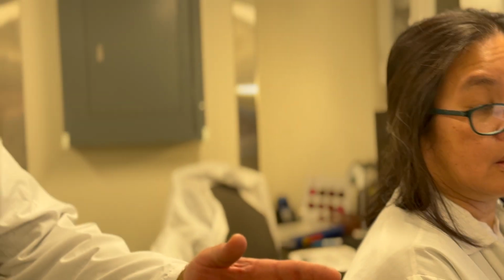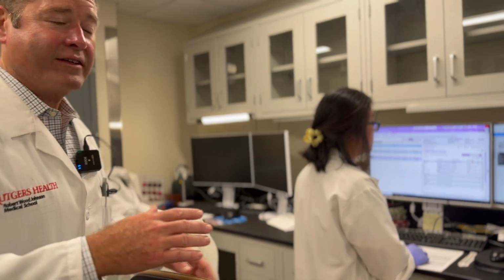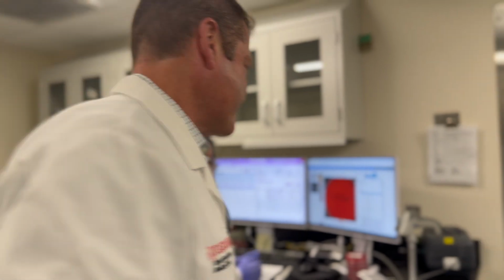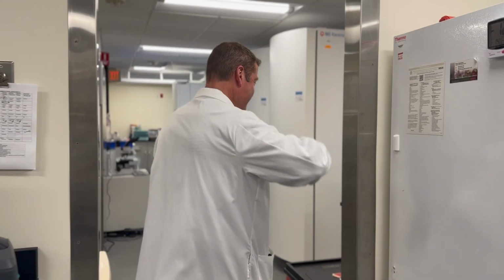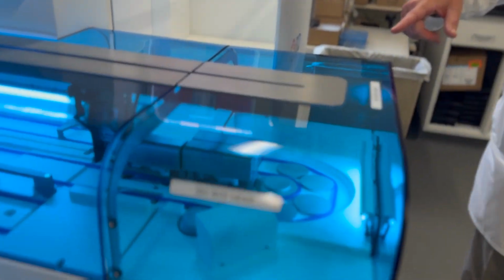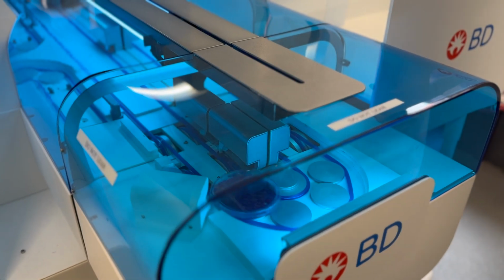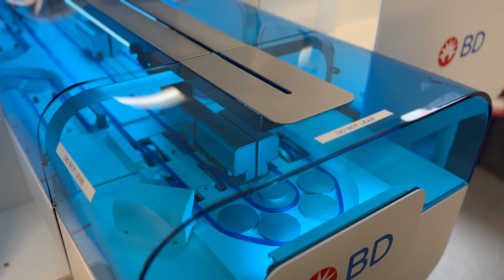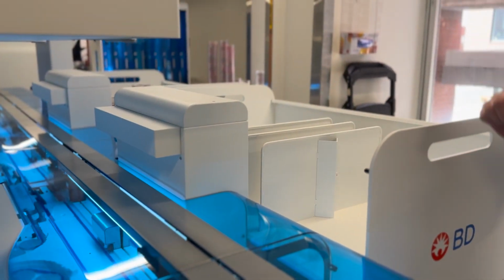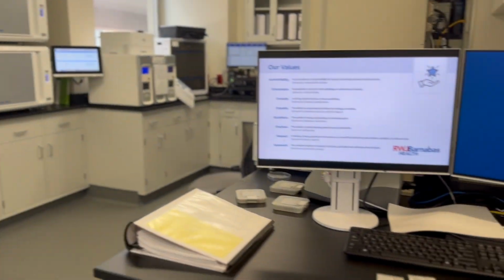Once we've identified the colonies that we're interested in working up further, colonies that we want to get a formal identification on and susceptibility testing, we'll move on over here to where we do that work. Thank you. Come on, let's go look. Hey, look, we've got some plates moving around the track here. They're coming down the track, and if Arlene over there told me that she wanted to work up one of the colonies that was coming through here, that plate would be spit out the back of the instrument, and I would pick it up. And then the technologist in this area would do the identification and susceptibility testing.